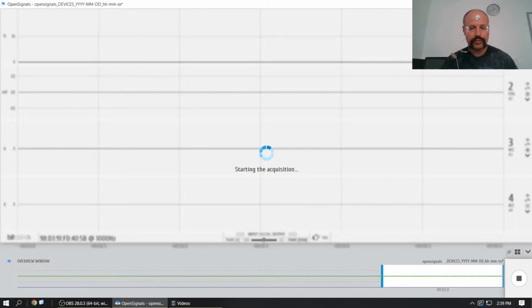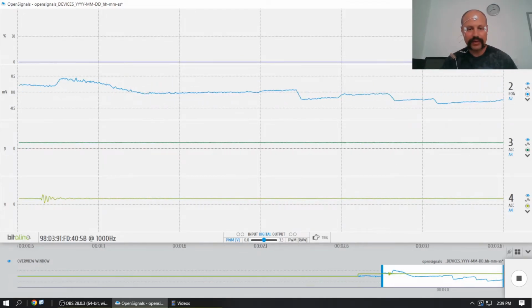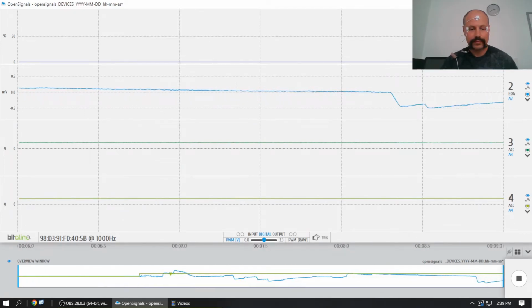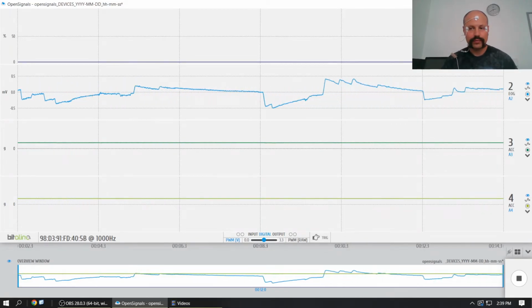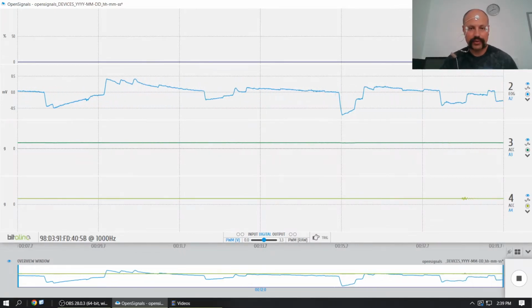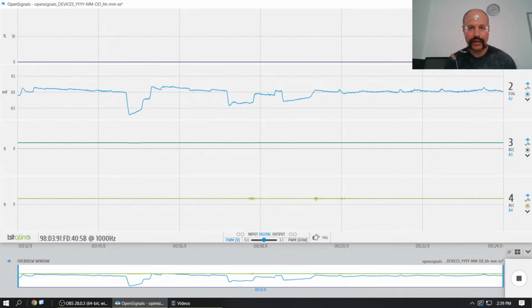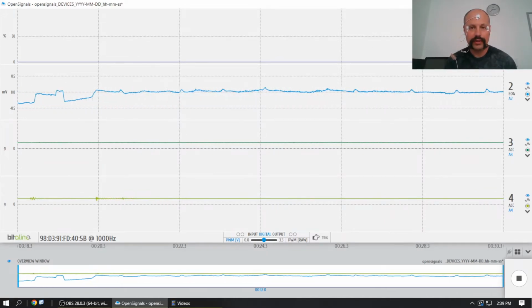It takes sometimes a bit long to initialize it, and sometimes it fails. But at the moment, everything goes well. So, pay attention to the second trace, which already demonstrates some kind of signal, but with simultaneous recording of the electrophysiology and the video, I will demonstrate to you that the signal has the polarity as expected.